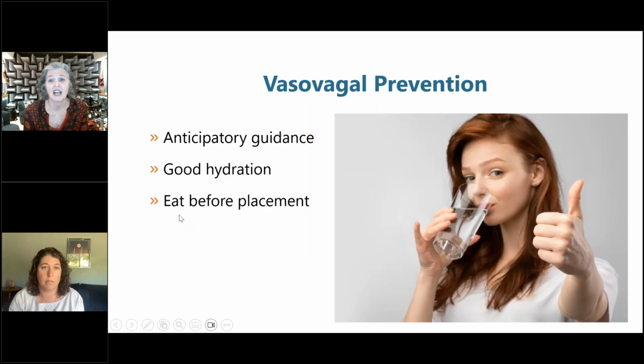I think that it's great to tell somebody beforehand, before they come in for their IUD placement, to make sure that they're hydrated and that they've eaten, because a lot of times people think they should be NPO, so that's really good to let people know. And in general, anticipatory guidance about how to prevent that vasovagal, once the vasovagal prodrome has started. I like to do right before the placement. So this is part of that pre-placement conversation.